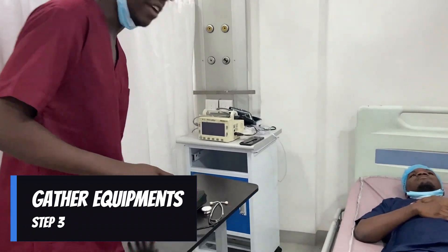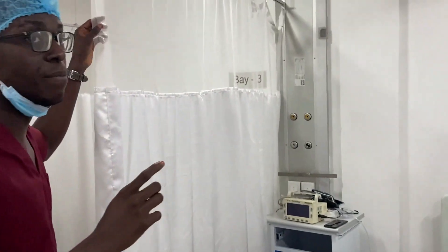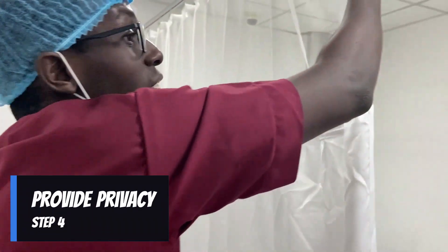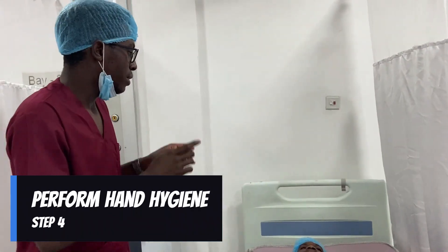You thank the patient, then move your equipment to the patient's bedside. Once you're done, you screen the patient, and then you perform hand hygiene. Another thing to keep in mind is that before you perform any procedure, especially vital signs, check whether the patient is on an IV line.